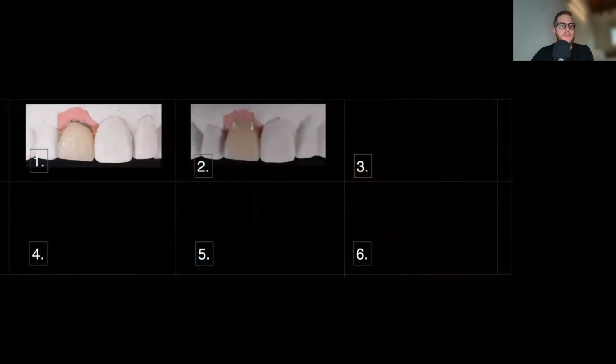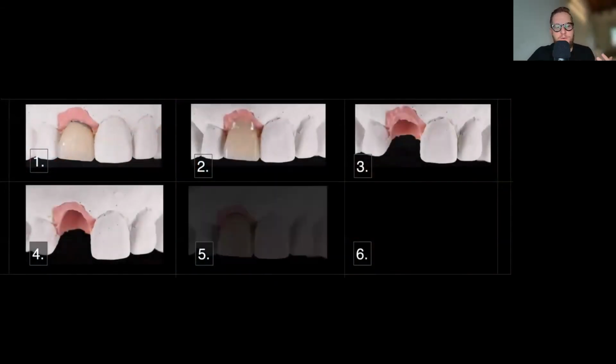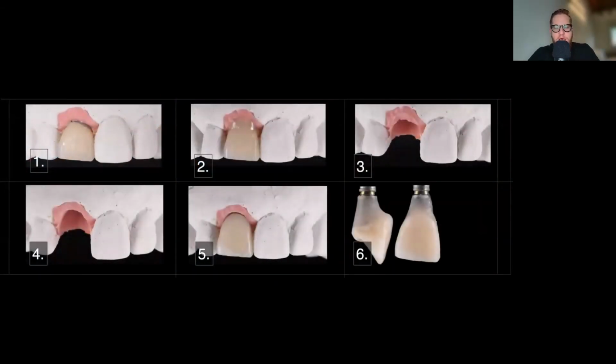So as you remember, we had a lot of tissue, and that's a happy problem because we did the graft, and we also coronally advanced the flap. And that way we had a very nice result at the end of the 3 months. And we don't like to do any type of crown lengthening and remove tissue that was very difficult for us to get in the first place.